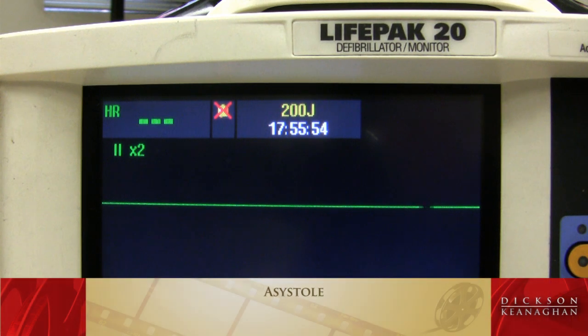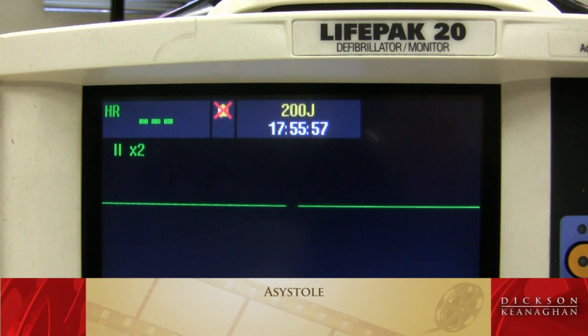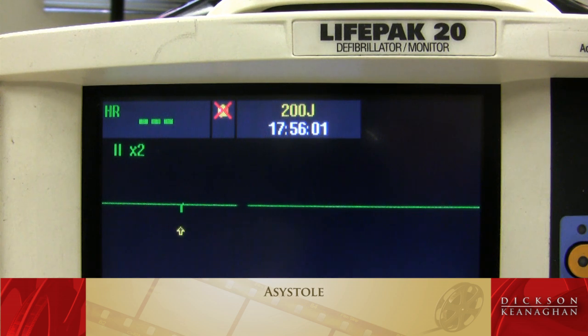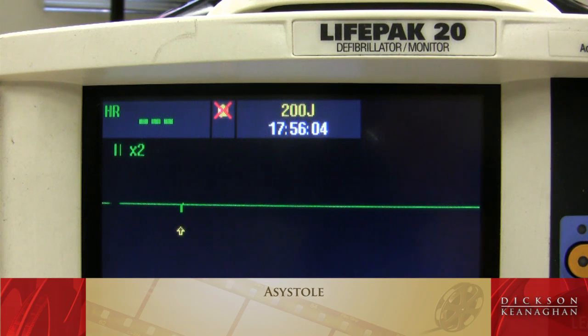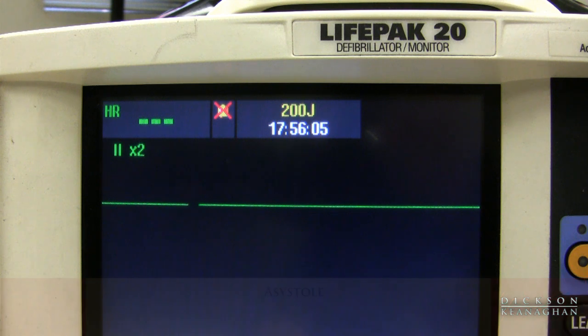Asystole — a deadly rhythm. We will check in more than one lead to see if maybe it is V-fib, but asystole has no rhythm. Start CPR.